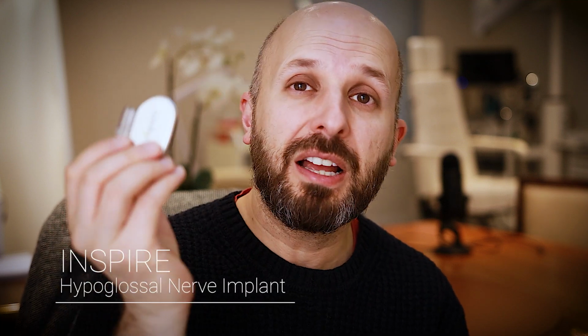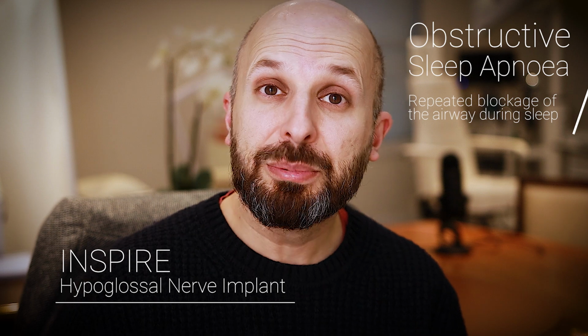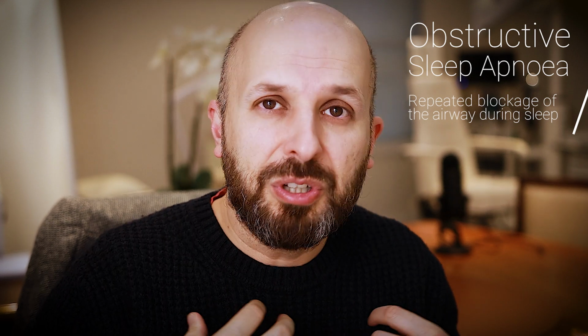And what I want to do today is tell you all about the Inspire Hypoglossal Nerve Implant for obstructive sleep apnea. Obstructive sleep apnea is when you can't breathe properly at night and you stop breathing, and it causes problems such as weight gain, high blood pressure, heart attacks, strokes, things like that. And the idea is that this device, which is an implant, helps you with that problem.